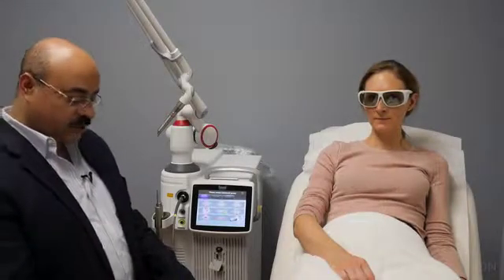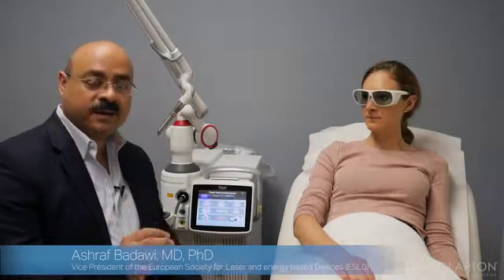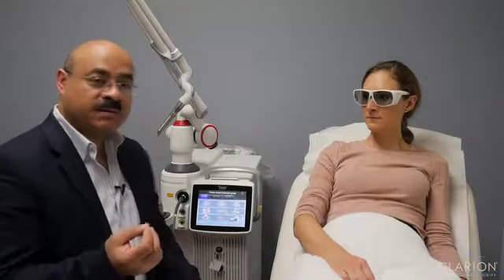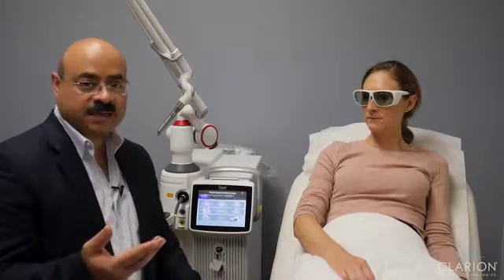So now we are going to be demonstrating treatment of epidermal pigmentation. And with epidermal pigmentation, as mentioned in the webinar, in the presentations, we can use pigment-specific lasers like the Q-switched lasers. When the pigmentation is epidermal, then we select the 532. When the pigmentation is dermal, then we use the 1064. However, sometimes treating pigmentation might require several sessions and the outcome might be not very satisfactory.